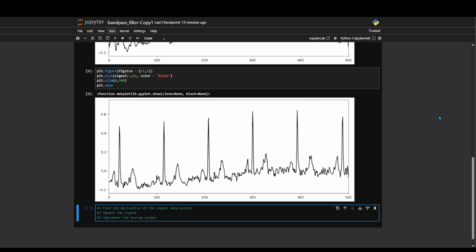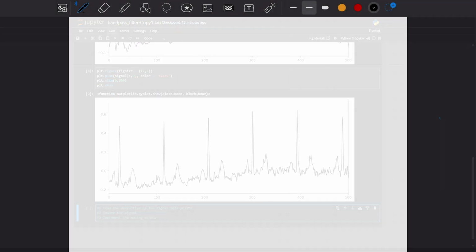Now, first I want to show you how it's done mathematically. We will perform convolutional operation. It's nothing difficult, pretty simple math, but still I think it's worth knowing how it's done. Now, for example, we have our signal, and these are numbers. These numbers are just random. It's just an example. And let's say we have 10 data points, 0, 1, 2, 3, 4, so on.